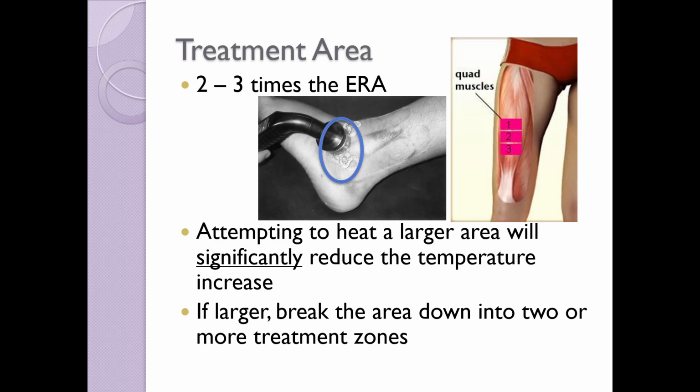When clinicians try to treat areas that are too large, it's commonly called washboarding. You have to cover a large amount of area, but the treatment does not have the physiological effects for either thermal or non-thermal treatment because the ultrasound head does not stay in one place for too long. It is not uncommon to see someone trying to treat an entire quadriceps or a back with one singular ultrasound treatment. The size of the treatment area for non-thermal treatments may be slightly larger, but there are no definitive guidelines that have been established.